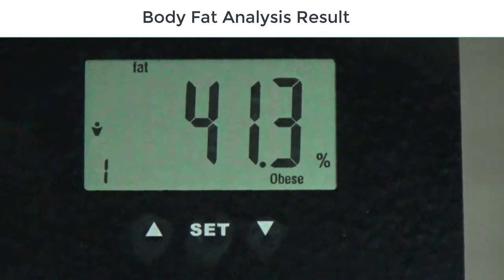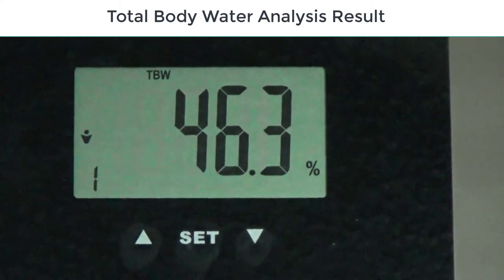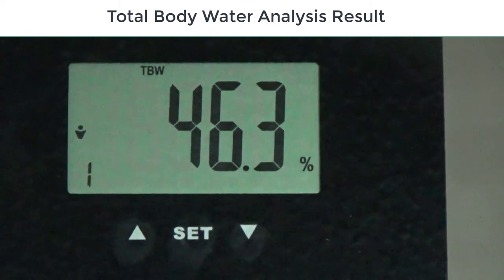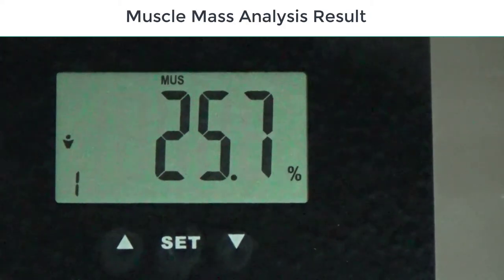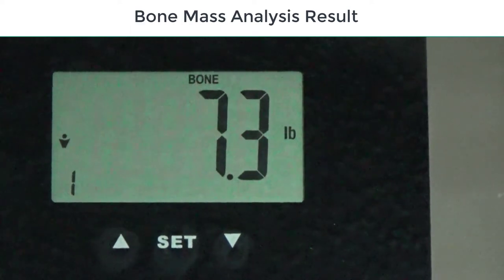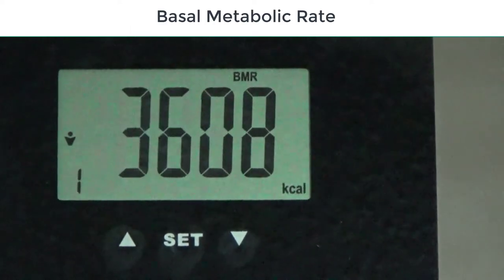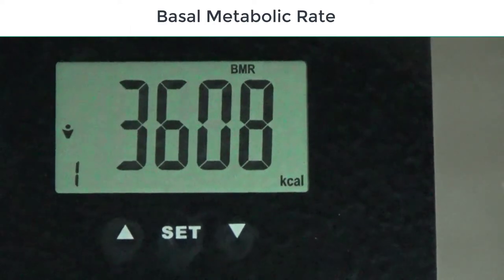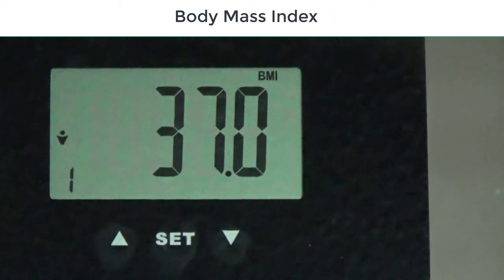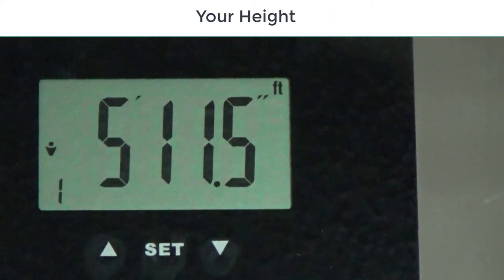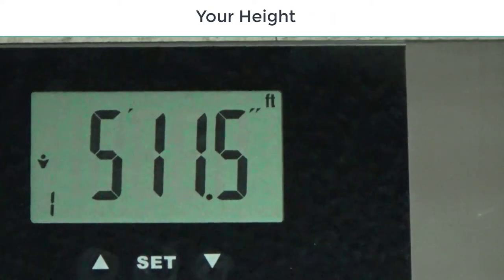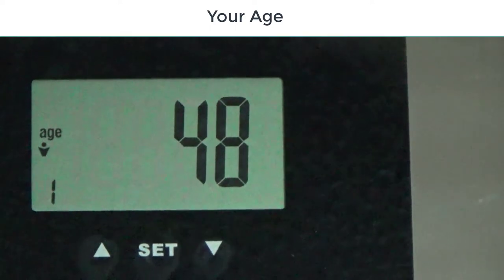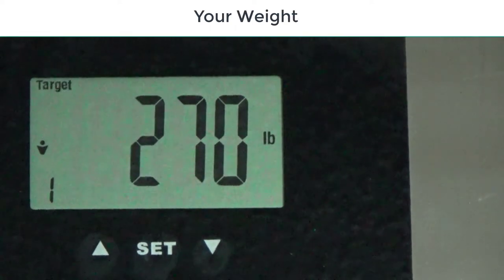Once it's got that, you see those little indicators, it's gonna go across. It's gonna show your body fat analysis results, your total water analysis result, your muscle mass analysis result, your bone mass result, your basal metabolic rate, your body mass index, your height, your age, and your weight. So that's all to it, it's real simple to do.